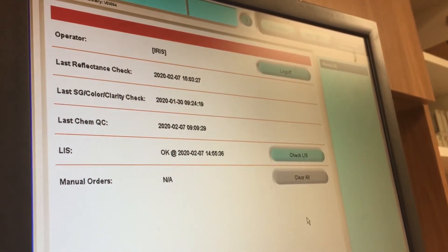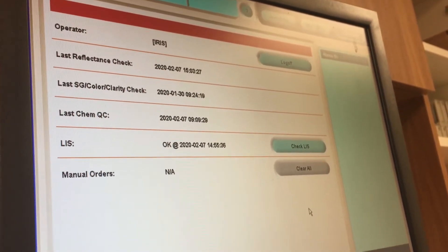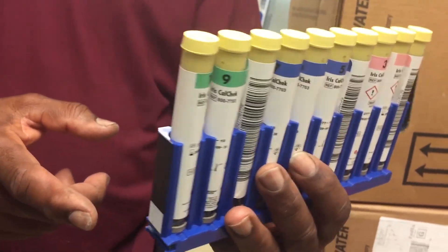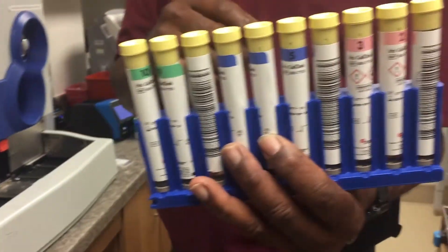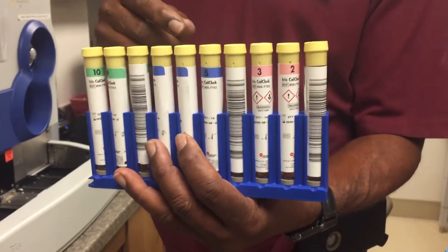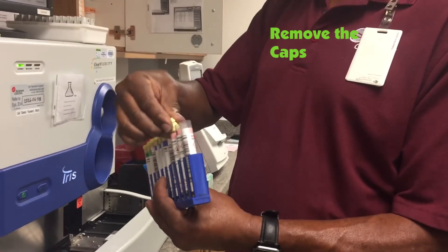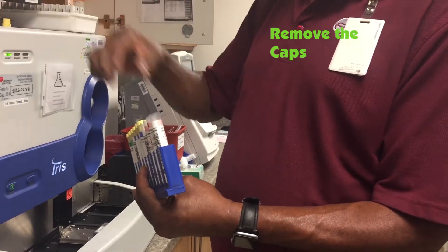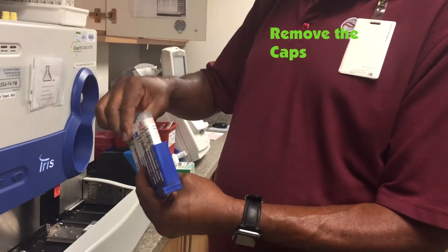So we're going to do the liquid QC. Do you have to select that on this one? No, I just put it in. I identify the rack, and then make sure that the barcodes are facing the instrument, like specimens. Very important — take off the caps. You've got to take the caps off, otherwise you're going to jam the probe into the plastic and you might bend that probe.